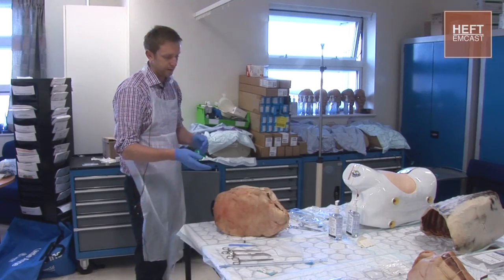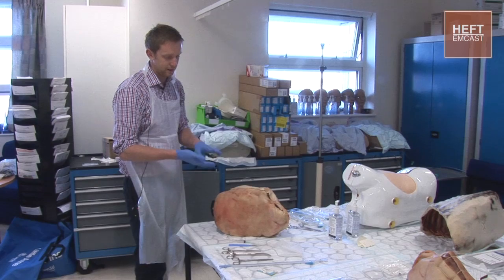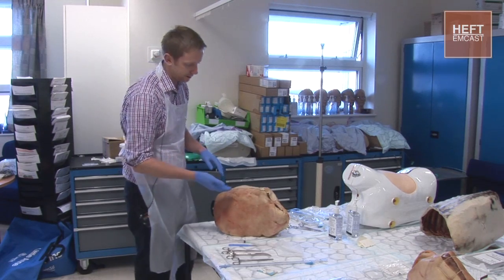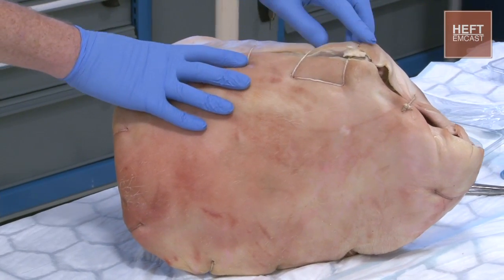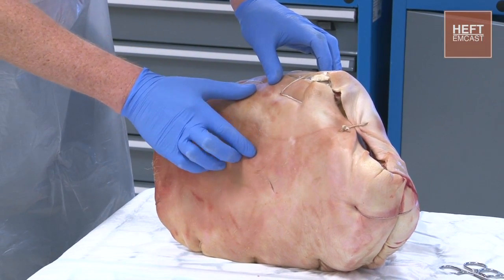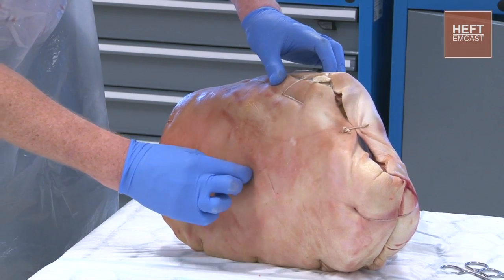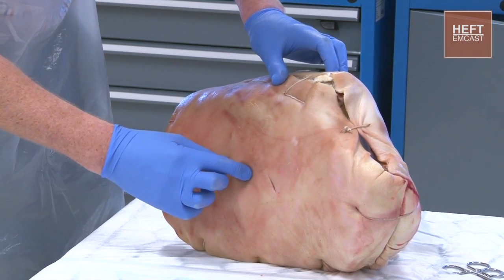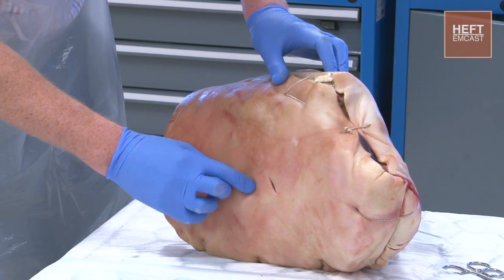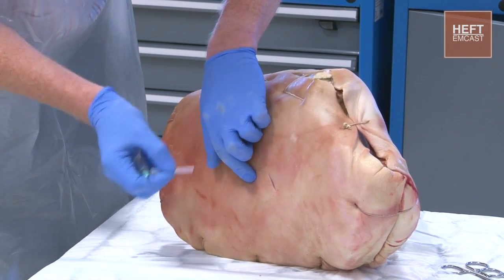The first thing you're going to do is identify the correct patient and confirm you're on the correct side as the pathology. You're then going to identify your landmarks — feel down from the manubriosternal notch and count down to the intercostal space that you're interested in; here it's going to be the fifth intercostal space. Identify that intercostal space with your fingers and when you're happy you're at the right landmark, infiltrate some local anaesthetic.